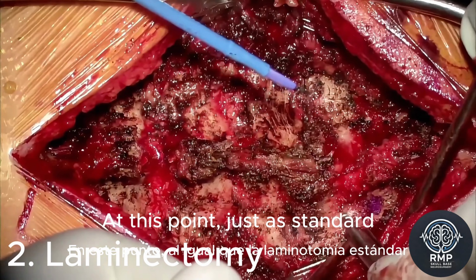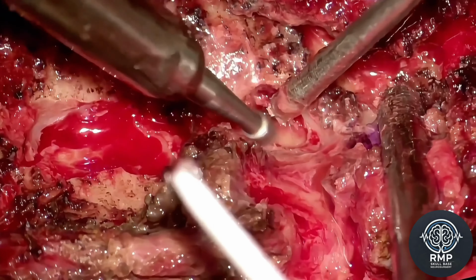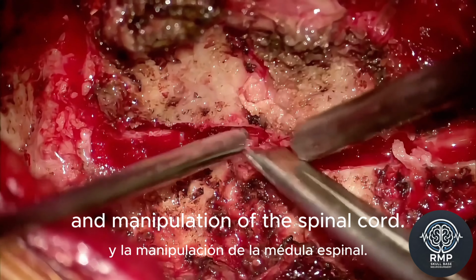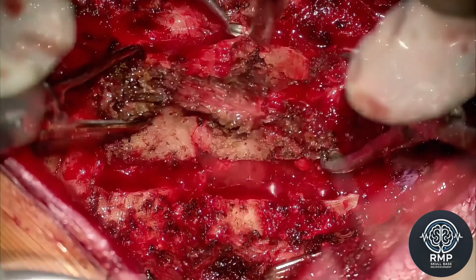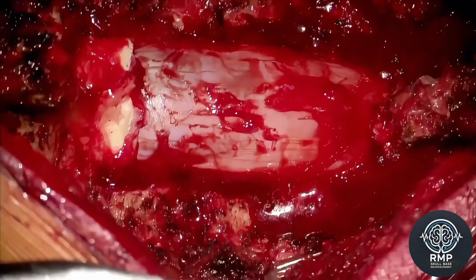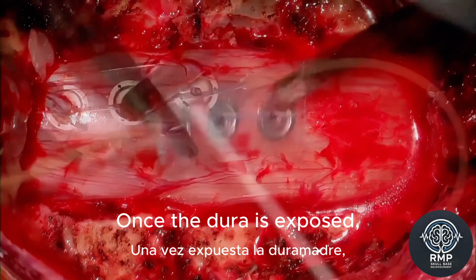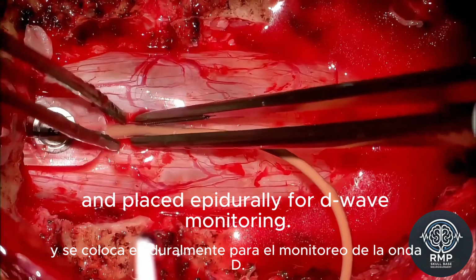At this point, a standard laminectomy is performed using a high-speed drill and Kerrison rongeurs. We always try to remove the lamina in one block to minimize the traction and manipulation of the spinal cord. Once the dura is exposed, a grid electrode is gently slid beneath the caudal lamina and placed epidurally for D-wave monitoring.